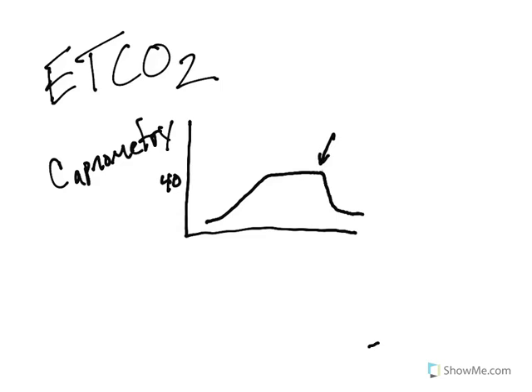Look at that, nice arrow there. At the peak of expiration, it's what we call the end of the tide, so end-tidal CO2. This is what we expect to see with normal expiration, and then, of course, during inspiration, our end-tidal CO2 levels will drop.